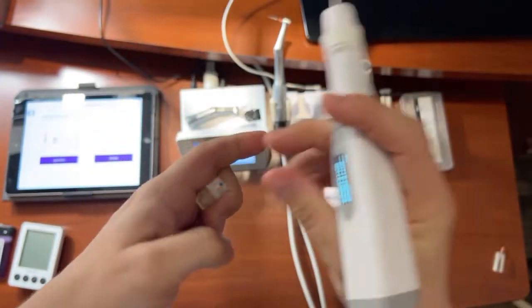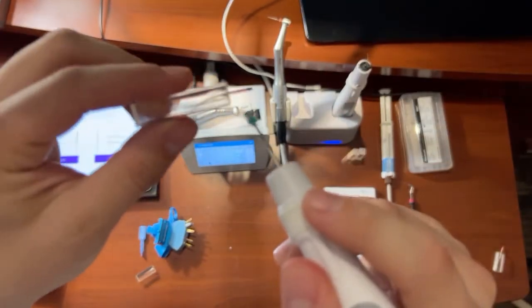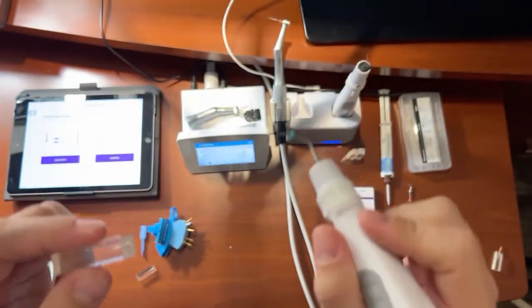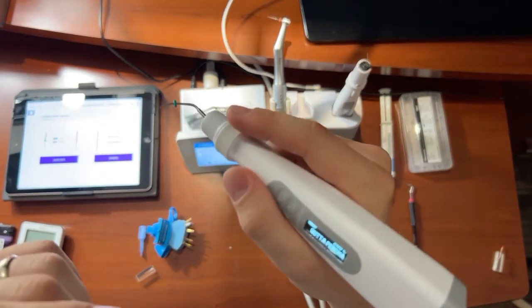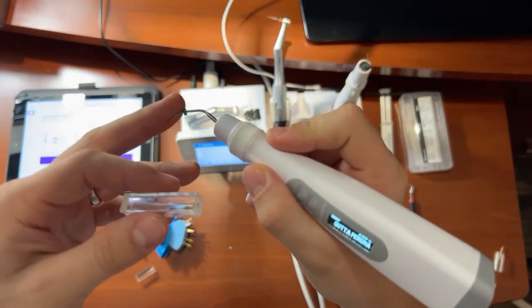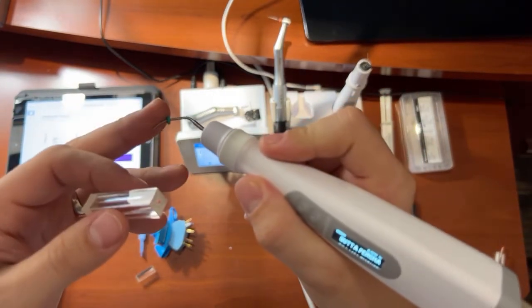So next, what you're going to do is you're going to sear off for access. So you just cut that off there. And really cool feature with this unit. So you'll touch it, it's instantly 200 degrees Celsius. But then when I touch the heat plugger, it's not going to burn the patient.